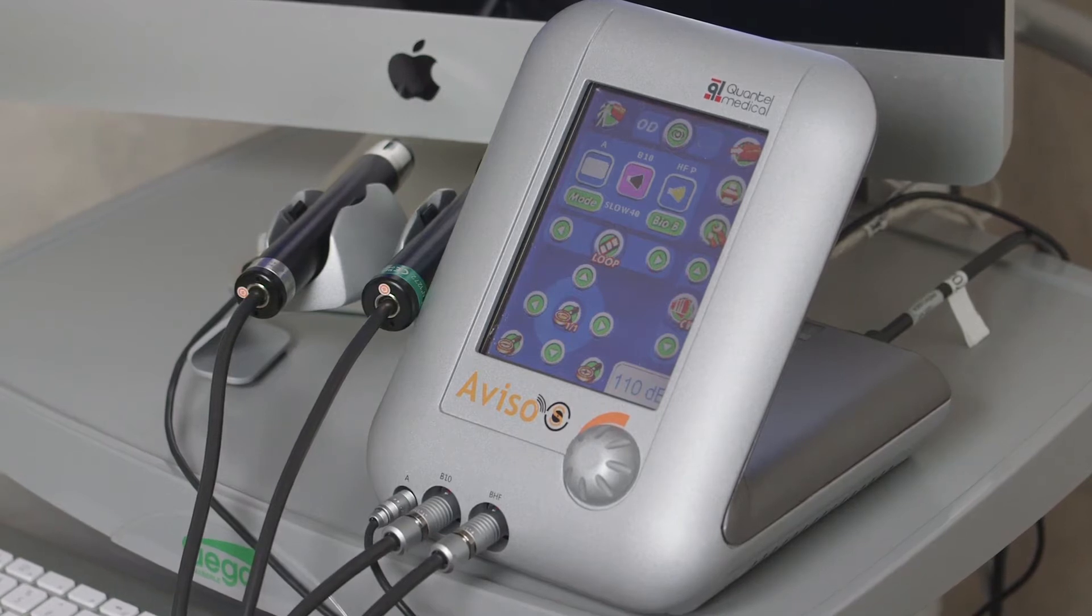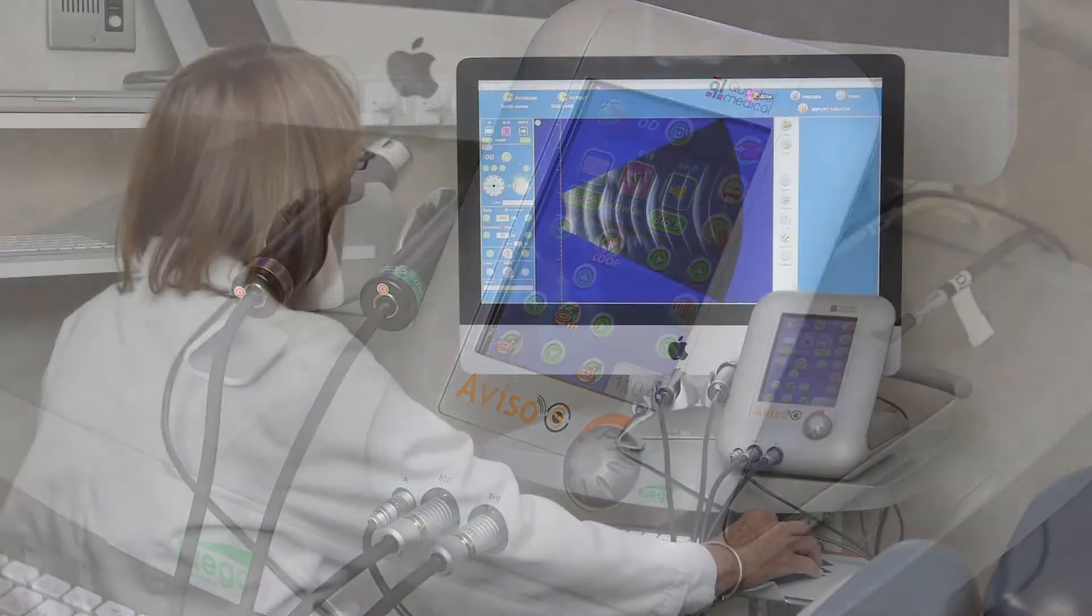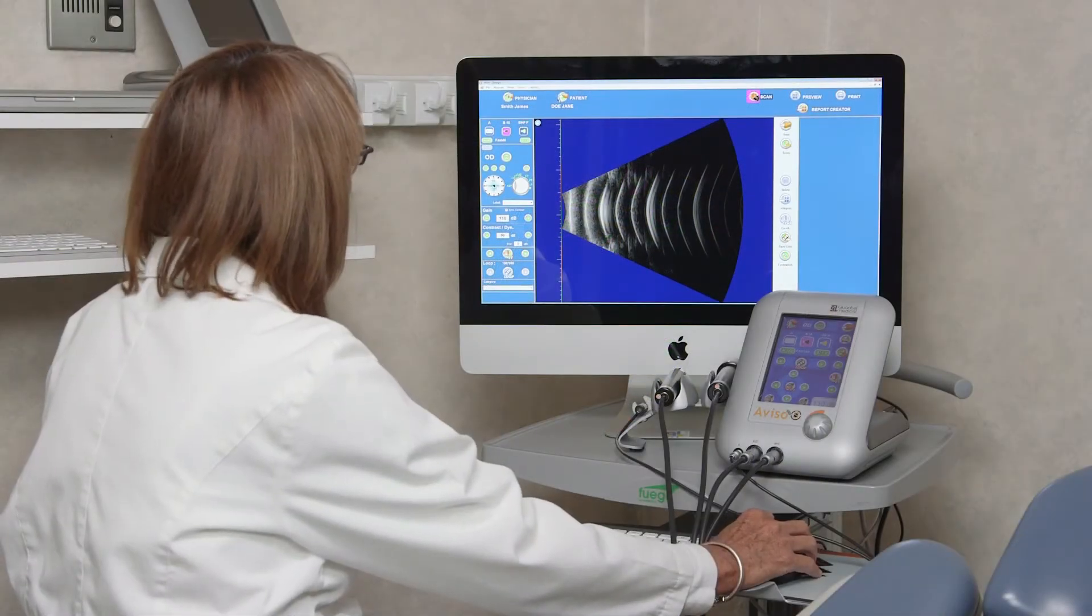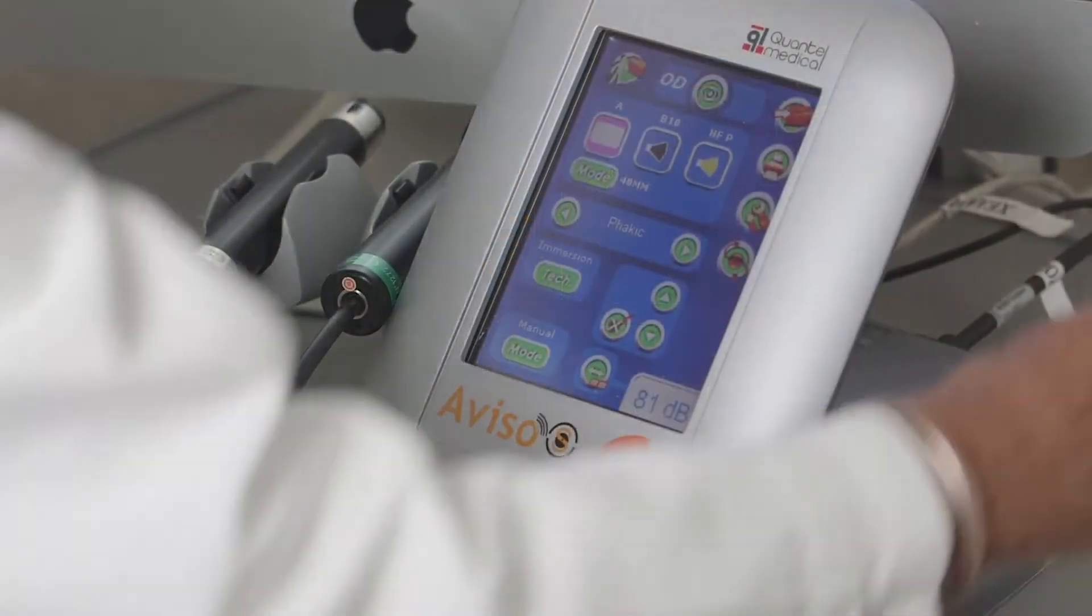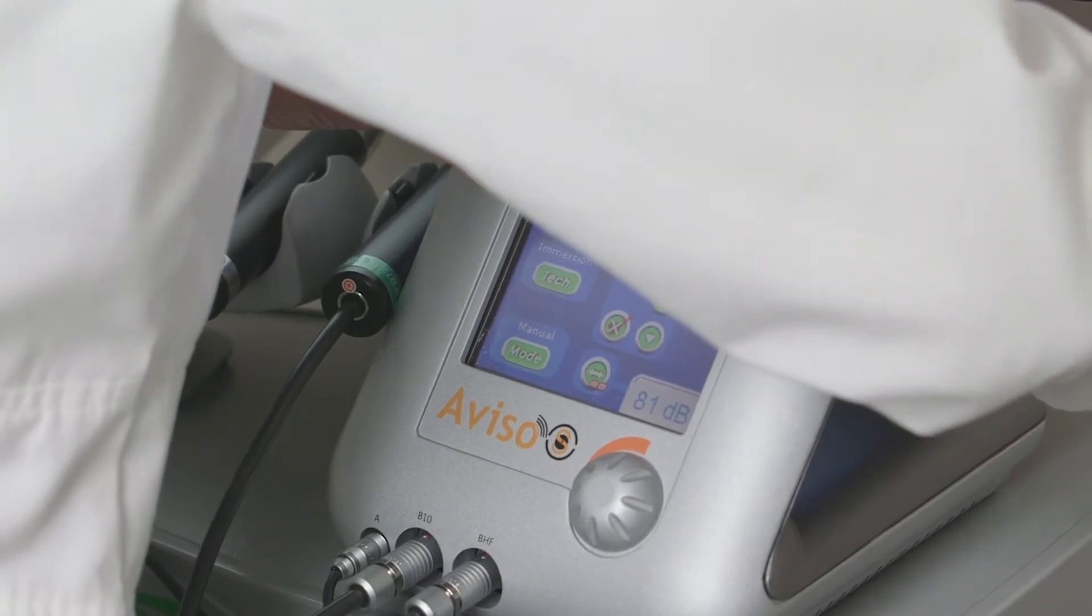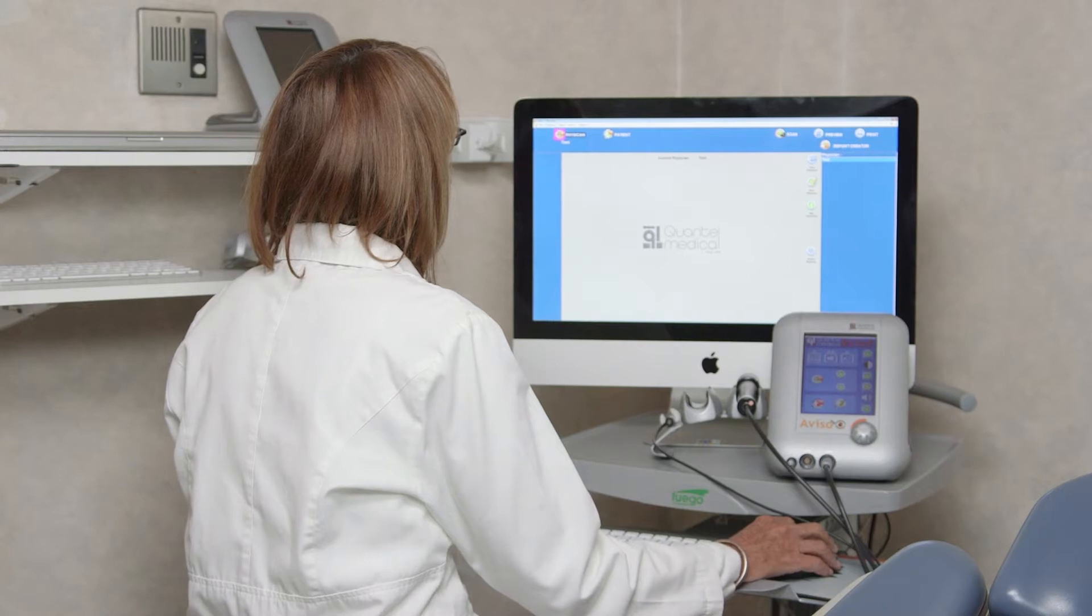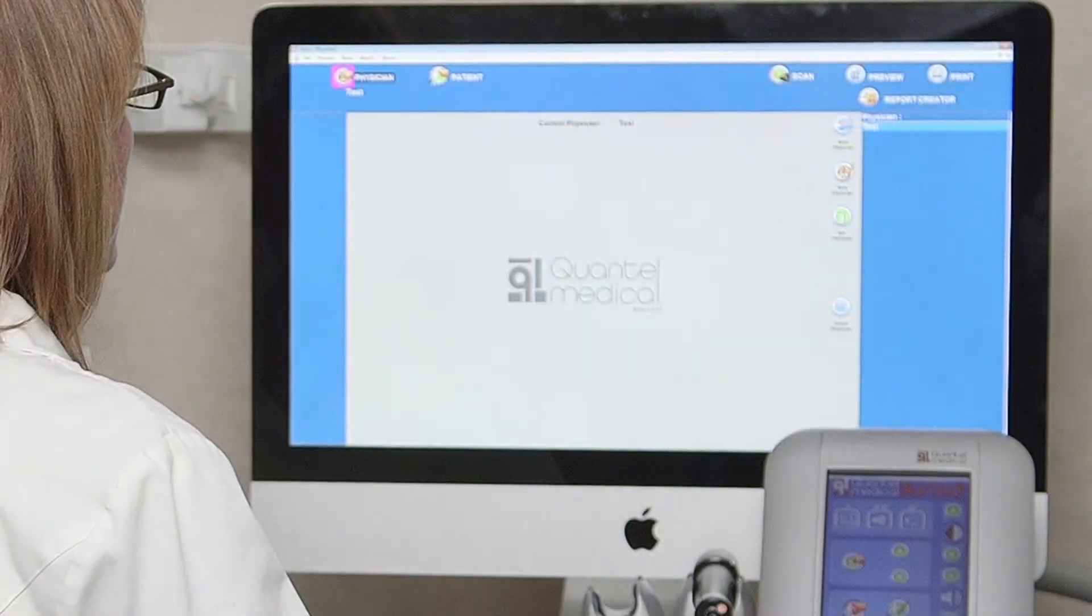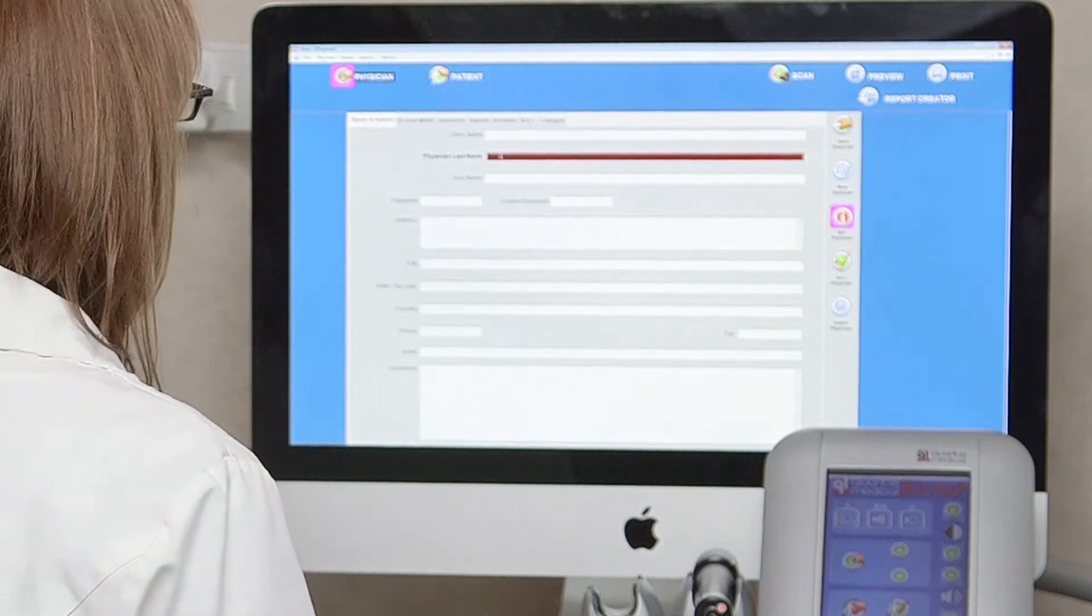The Aviso-S is designed to be connected to a laptop or desktop computer where exams, images, and reports are displayed. Image acquisition can be controlled via the computer or touchscreen. We start by turning on the main unit via the power switch on the back. Once the unit is switched on, the connected computer should automatically open the Aviso-S software application. The software can also be accessed via the Aviso-S shortcut icon on the computer's desktop.